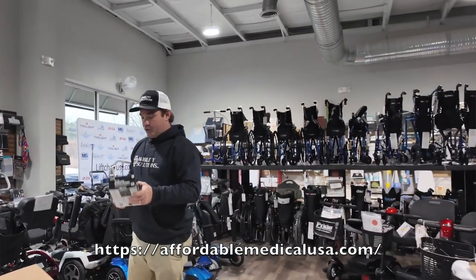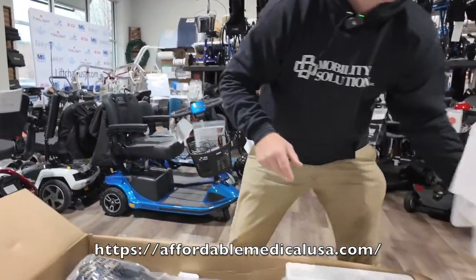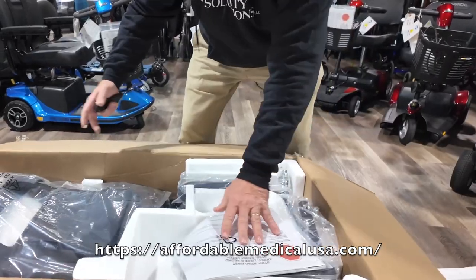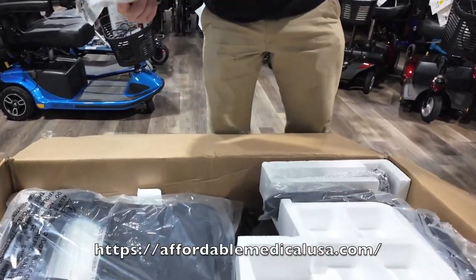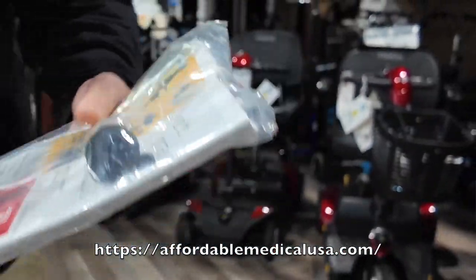Here's your charger. It's packaged very well with a lot of styrofoam. Inside you'll find your manual, a serial number, a key, and these little pins.